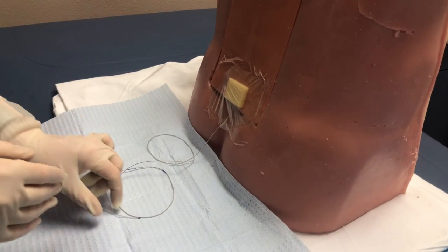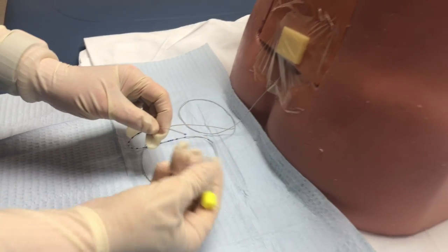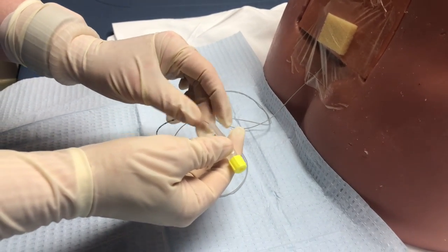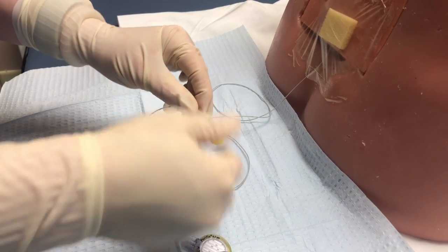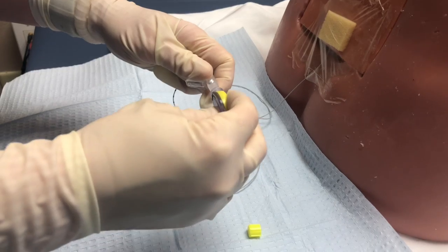A catheter to syringe adapter is placed on the free end of the catheter. Gentle syringe aspiration is applied to the catheter. However, a negative aspiration test does not guarantee that the tip is in the epidural space. The catheter adapter can be connected to a pump programmed with low concentration local anesthetic, ensuring that the patient is receiving a constant amount of local anesthetic per hour.